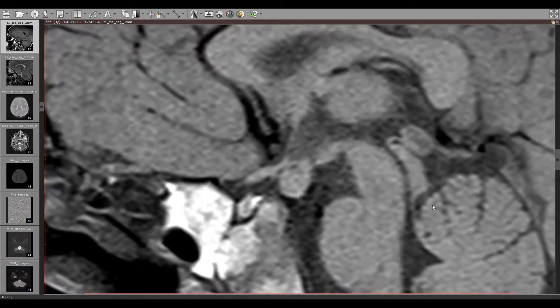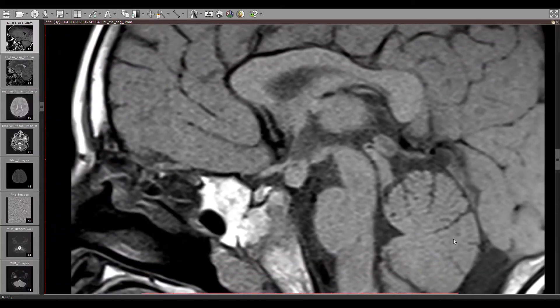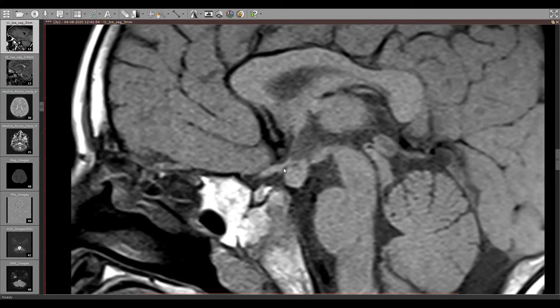These are the sagittal T1-weighted images. This is the optic chiasm, mammillary body, region of the hypothalamus, the pituitary gland inside the sella, the stalk. We see that there's a rounded T1 iso-intense lesion between the optic chiasm and mammillary body arising from the floor of the hypothalamus.